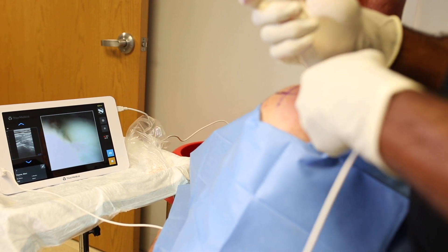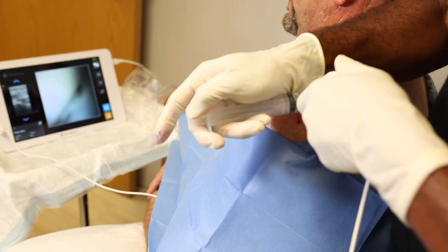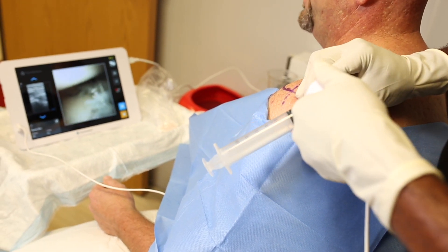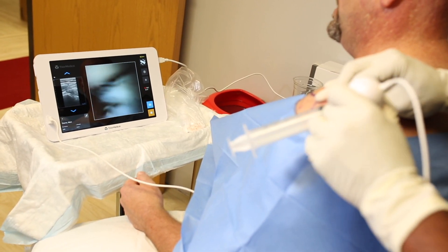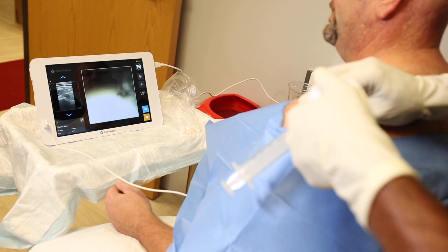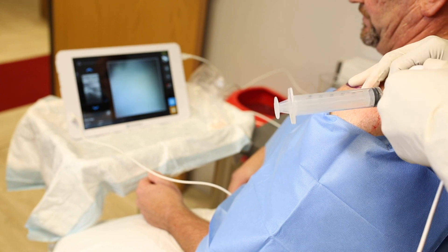In this case we can see some degenerative changes and even some loose bodies — the patient has had prior surgery. We can manipulate all through the joint using a minimal amount of normal saline to maintain visualization. Our goal is not to distend the joint with 100 cc's of saline, but simply to keep enough in the joint so we can see. We don't have cautery; this is purely a diagnostic scope. For those used to operating in the lateral decubitus position, you can turn the scope 90 degrees to mimic that orientation when identifying anatomy and pathology.